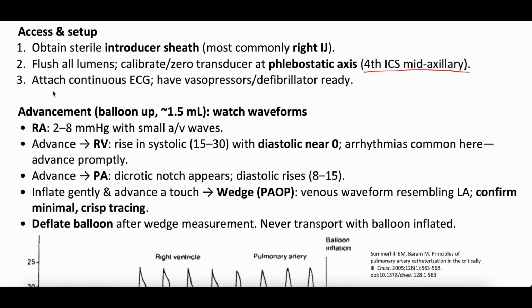And then many people will attach continuous EKG leads. If we're being honest, again, this is never intended to be acted upon as medical advice. Please check out the disclaimers in the episode description or at the end of the episode. But we don't tend to do the continuous EKG lead. We focus very much on the waveform.